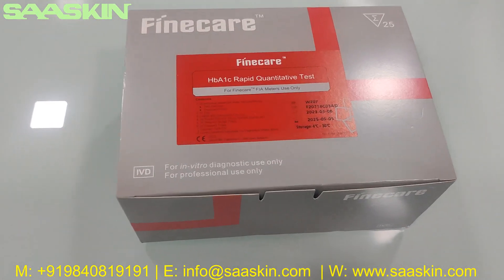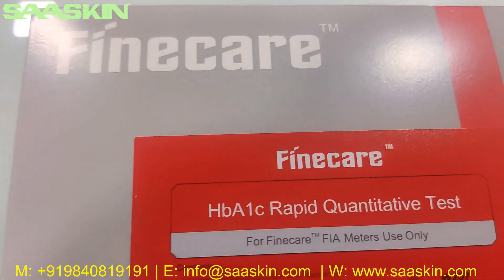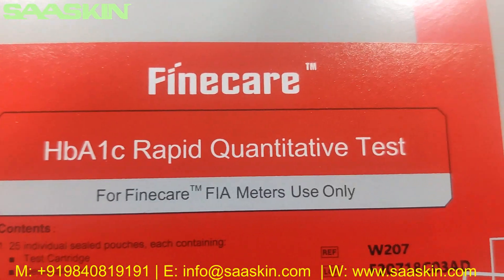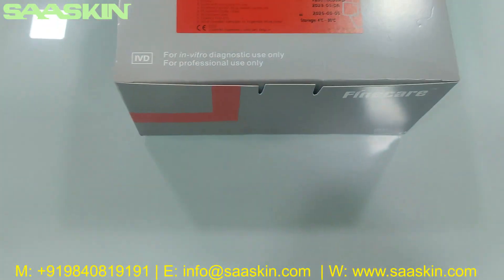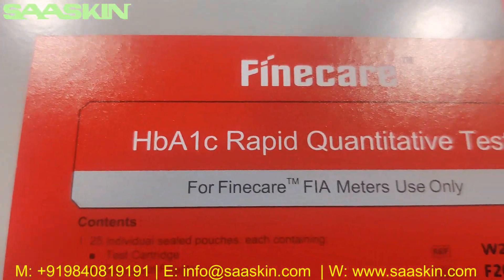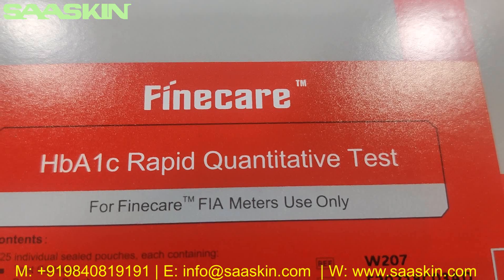Hello everybody, today we are going to see the unboxing of the FineCare HBiNAC Rabbit Quantitative Test. This is to be used in the FineCare FIA meters only. You can see the product — it is from Wanfo FineCare HBiNAC Rabbit Quantitative Test.